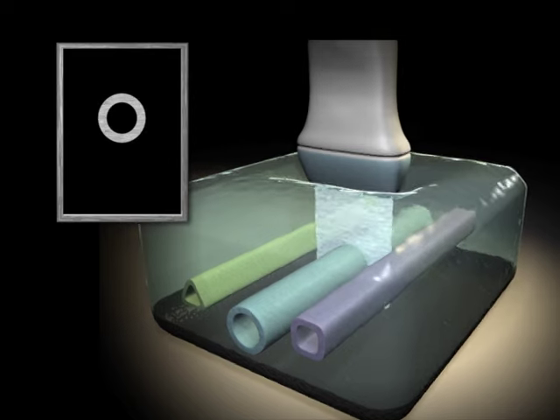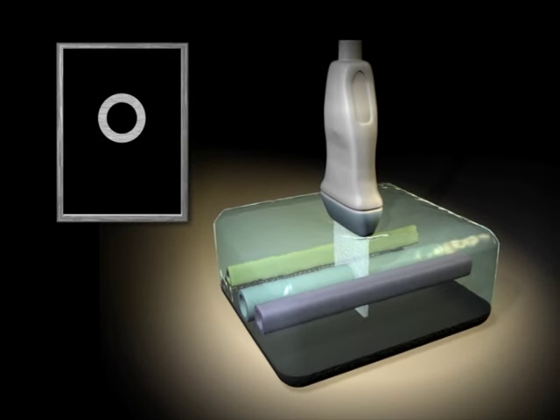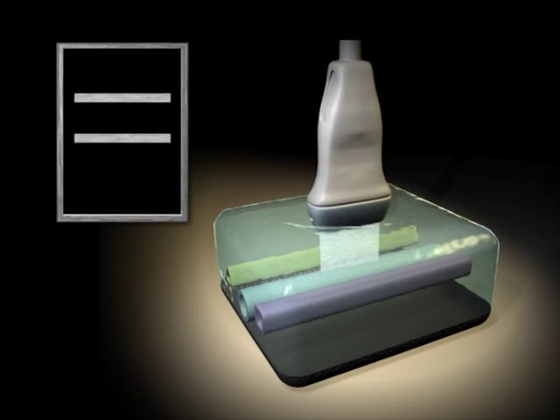Short-axis imaging cuts the cylinder transversely, revealing a circle. Long-axis imaging cuts the cylinder longitudinally to create two parallel lines. Long-axis imaging is of limited use in ultrasound-guided peripheral nerve blocks.